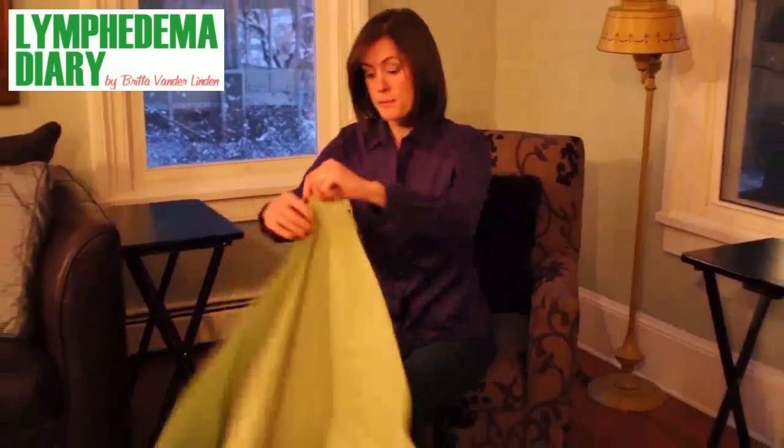I recommend using a travel yoga mat. A travel yoga mat is thinner and lighter than a regular yoga mat, and it folds up small so you can tuck it under your bed or in a drawer for easy storage, or put it in your luggage for when you travel. If you don't have a travel yoga mat, any large beach towel will do.